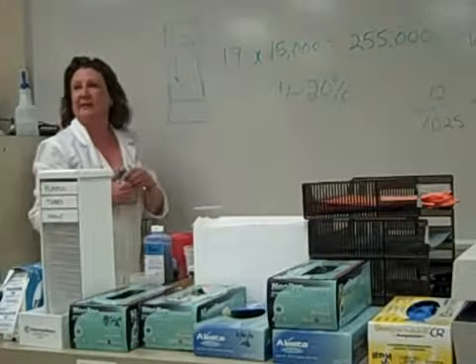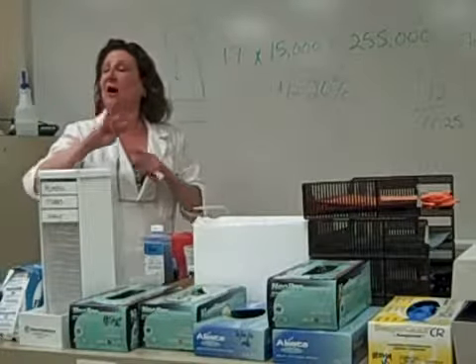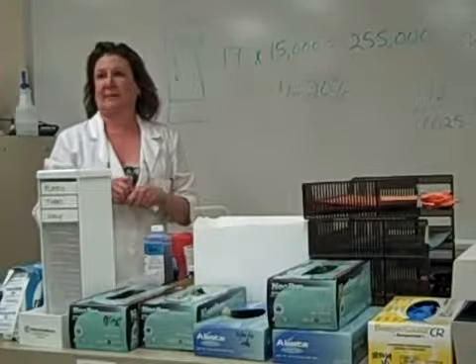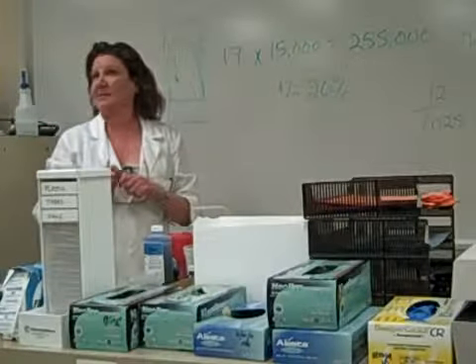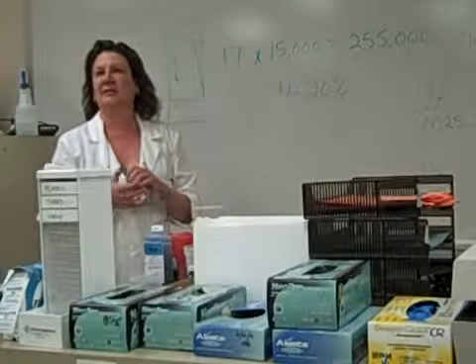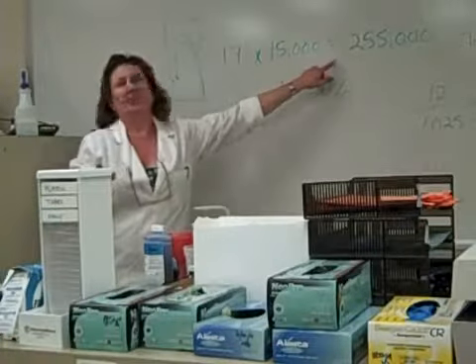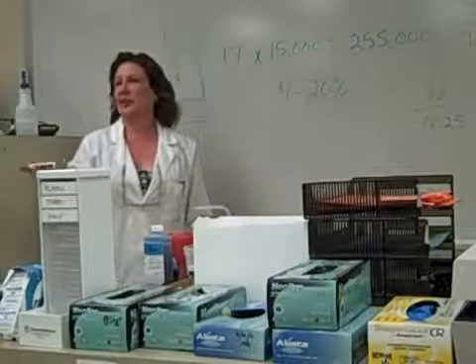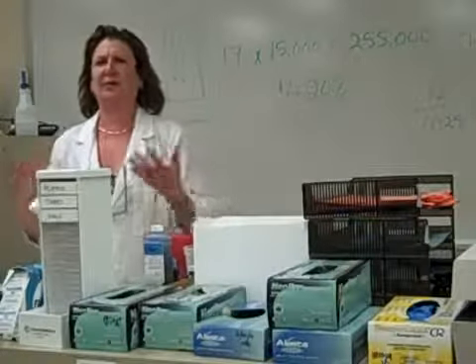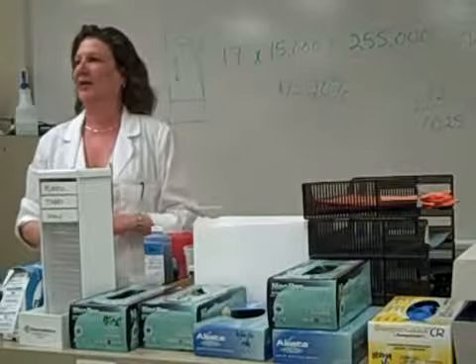Okay? Yeah, David. How many platelets do you do? I want you to do a platelet estimate on all the diffs you do today. Okay, so it's going to vary. Some people may be close to being done. Other people may need more. But you got to do the platelet estimate on the practical. So just make sure you feel comfortable and you're getting good platelet estimates when you go. Any other questions?